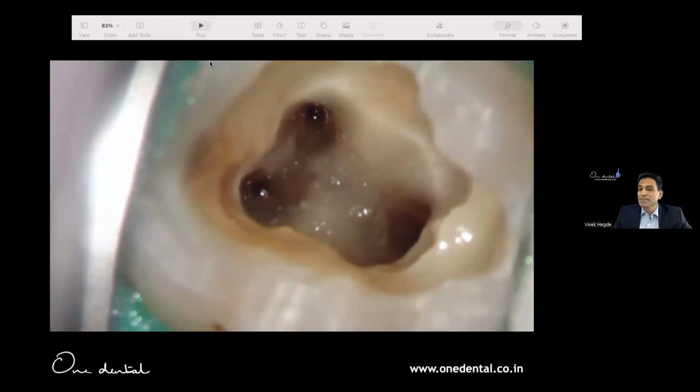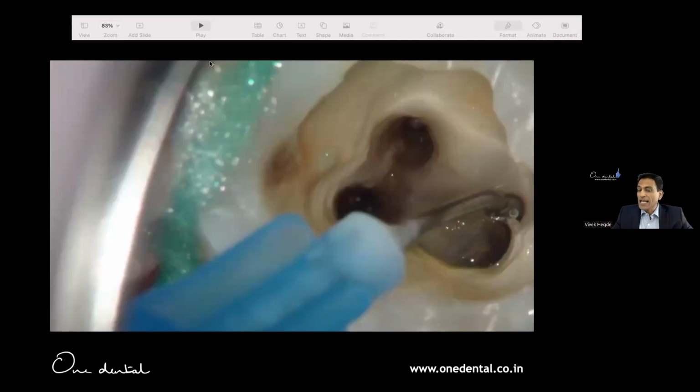Now I know my canal system is clean. And then I aspirate it. You can micro aspirate it. How do you do it? You can take a larger, longer, broader needle, lock the needle into the system, and suck it dry if you don't have microsuctions. Microsuction is one good system to do it. Beginners, youngsters who don't have the access or don't want to do it now, fair enough.